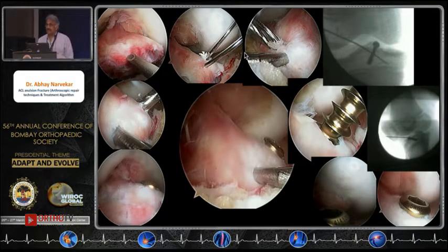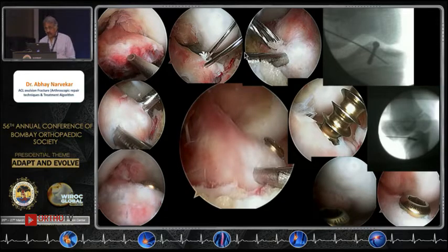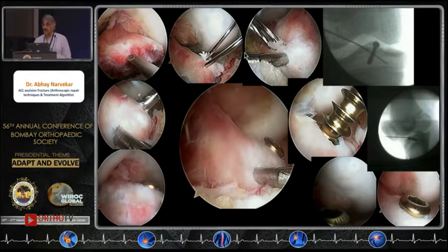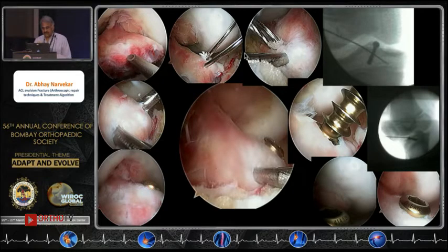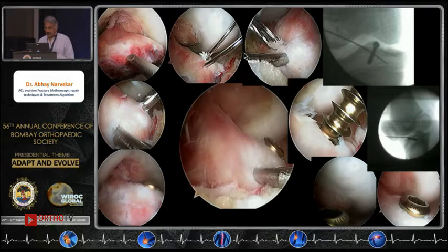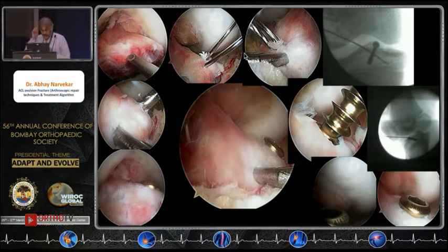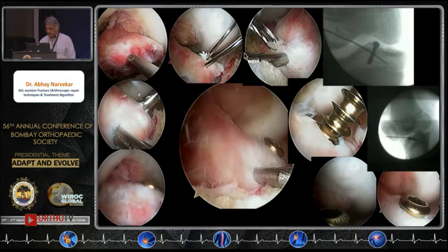Use the C-arm to ensure you do not go through the epiphyseal plate. Your angles should allow an oblique approach and avoid the anterior superior fracture surface. Once you flex and extend, confirm that the screw head does not scuff the articular cartilage of the medial femoral condyle.